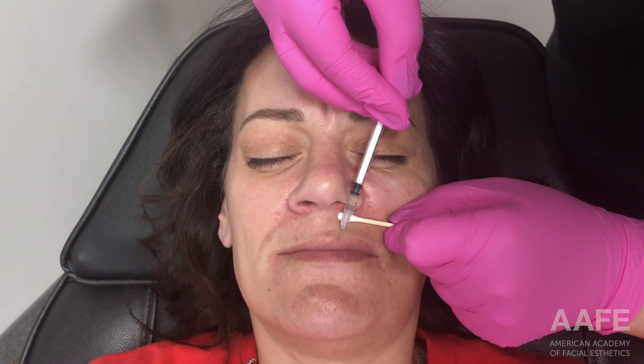Hello everyone, welcome back to another YouTube video. Today we are doing some lips. Prior to this, she was completely numbed with topical anesthetic, some BLT, cleaned off really well, alcoholed — she's nice and clean, and now we're going in and injecting.